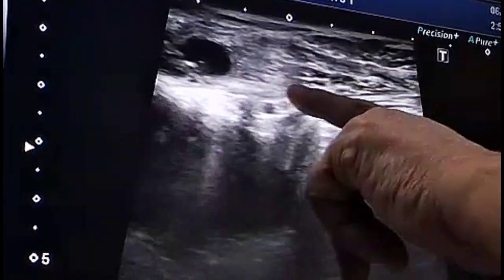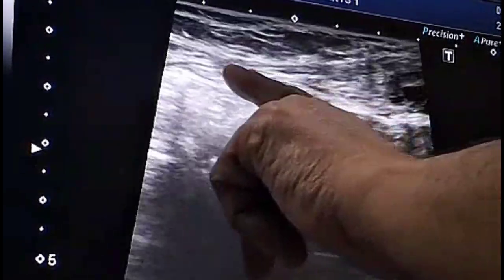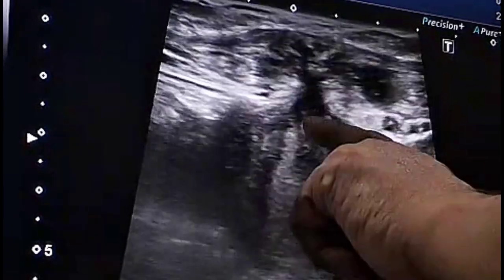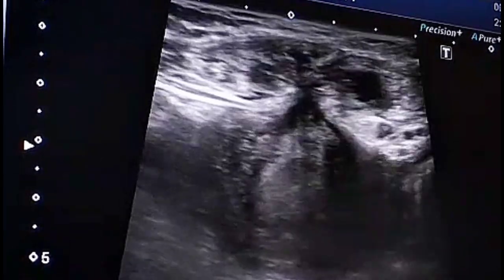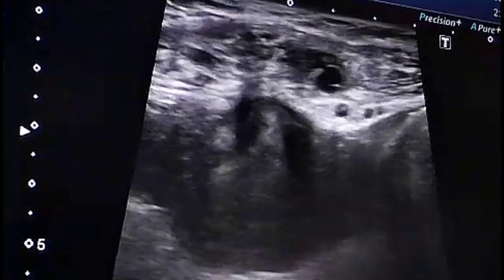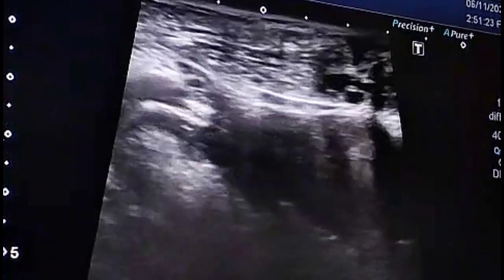So this is the muscle, and you see this is a mass in the muscle, but it is very irregular in shape and mixed pattern. There is a tract. You see, this is a tract. Some endometrial tissue may have gone to this tract, to the site, and you can observe it.